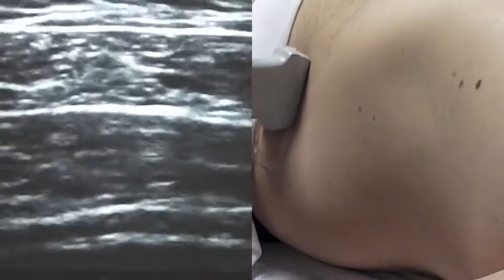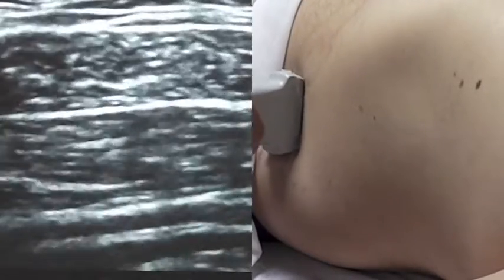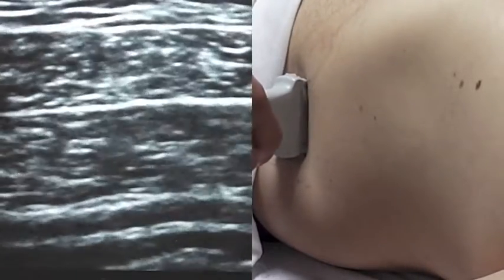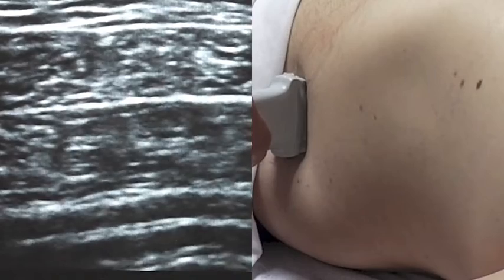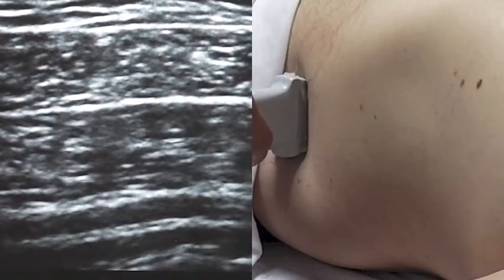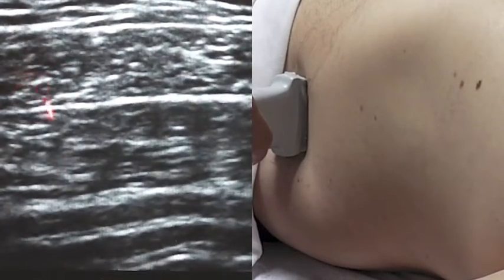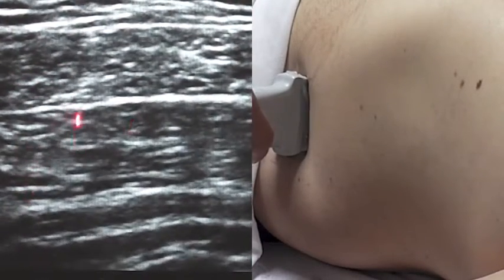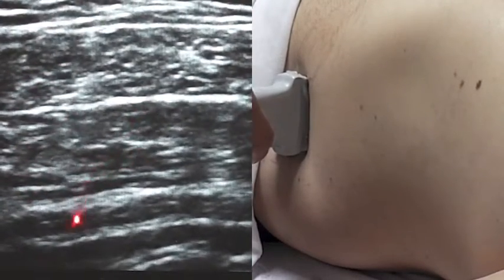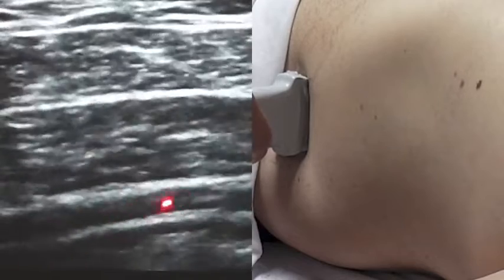Scanning back medially, you can see the three layers come back into play: the external oblique, the internal oblique, and the transverse abdominis.